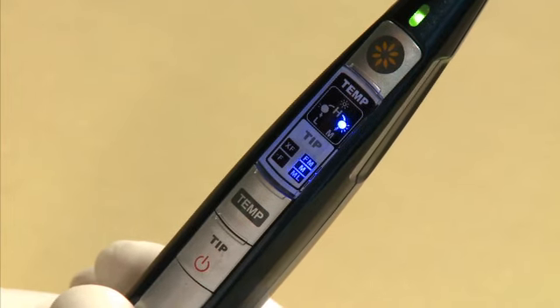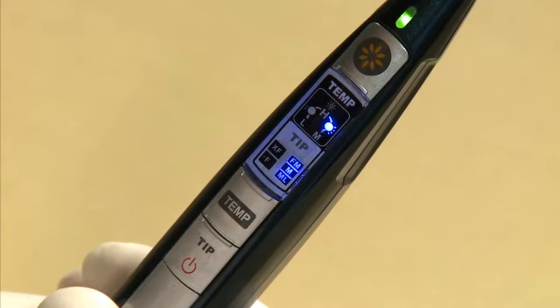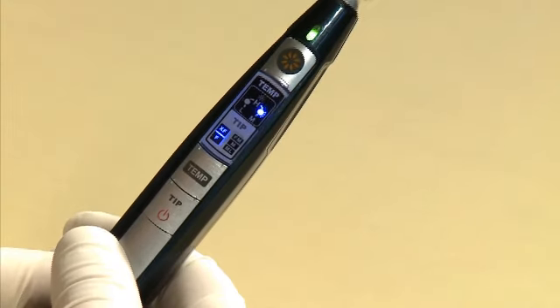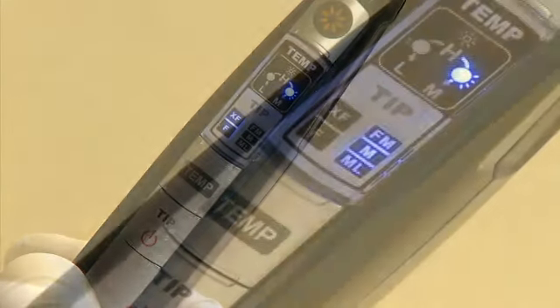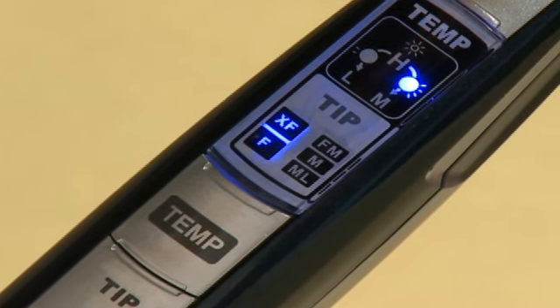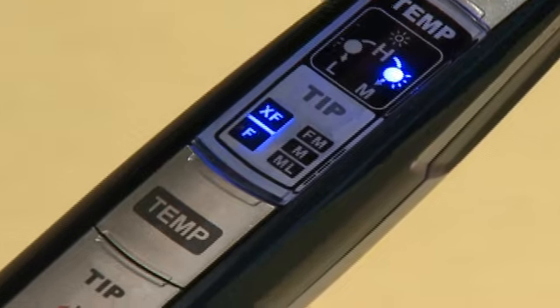Press the tip button to change the tip setting. Pressing once will change the tip size to F/M — the M and L indicators will light up. If the tip size is not set properly, the temperature will not be correct for your intended use. Please make sure that the tip size displayed is the size you intend to use.